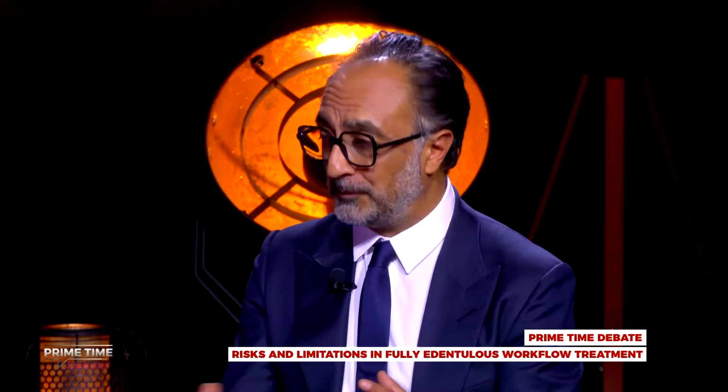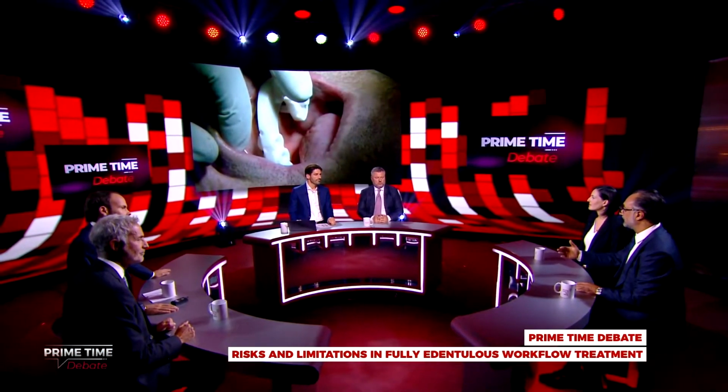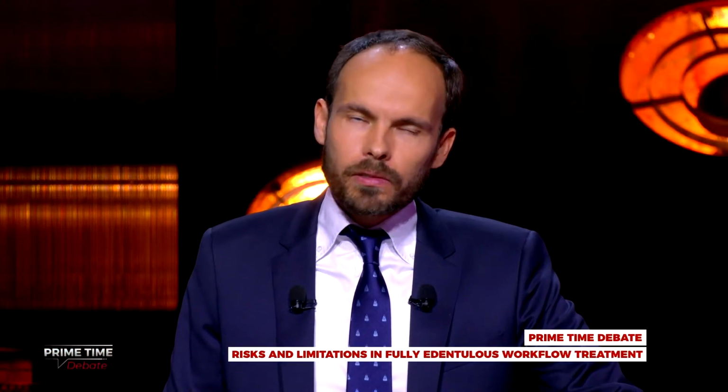Reference implants, yeah, if you lose them. So that's why you have to keep the treatment as short as possible, within the range of 2 weeks, from placing the mini implants right away to placing the implant, which is technically possible if you have everybody on the team in the right position and prepared. Including the lab, I guess. Exactly. Also the transfer towards the laboratory using those mini implants helps a lot to reassure the positioning of the setup.